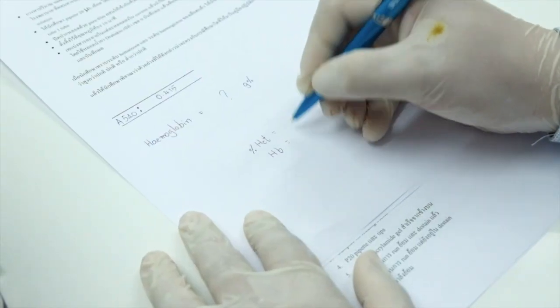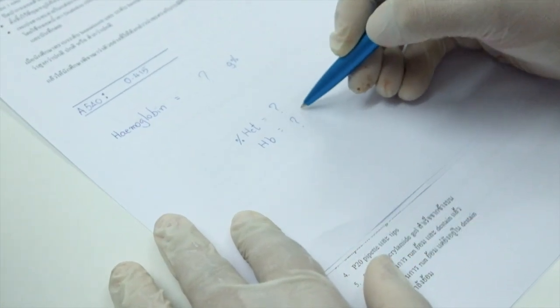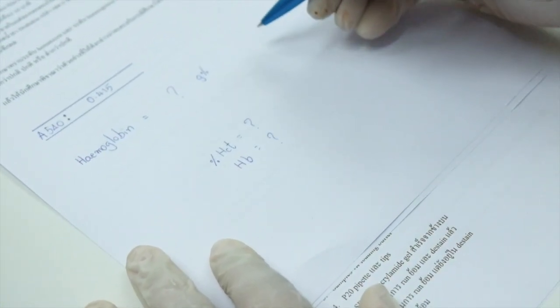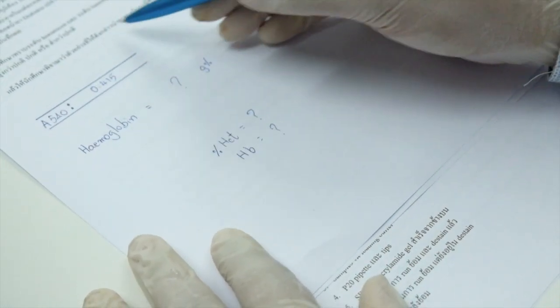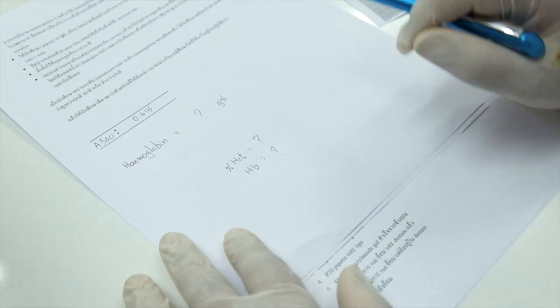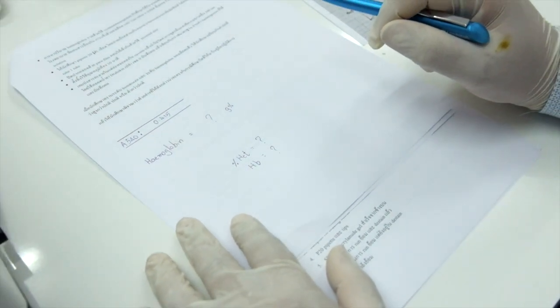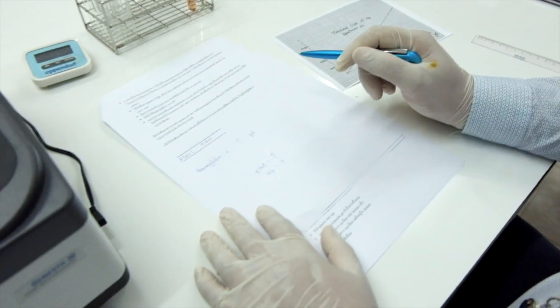When you have all levels of hematocrit and hemoglobin in the unknown blood sample, compare the values with the normal range. Finally, hypothesize whether all the results are the likelihood of which of the cases reported in your laboratory manual. That's all.